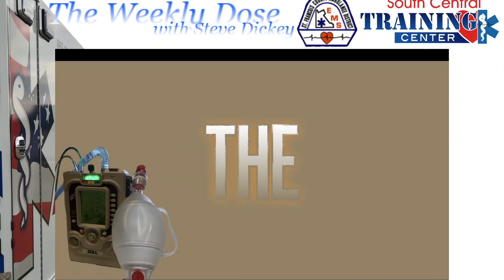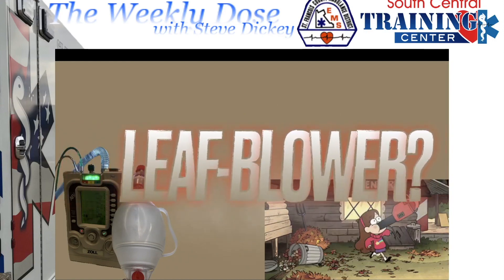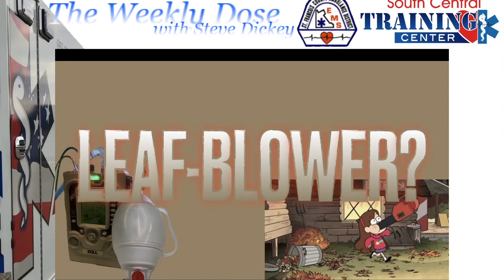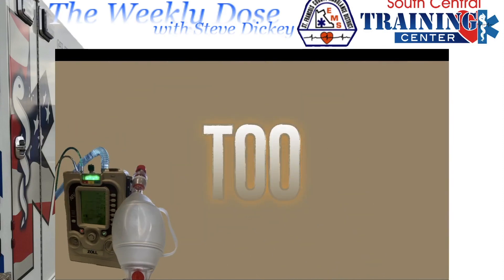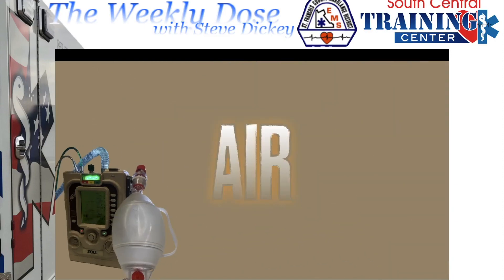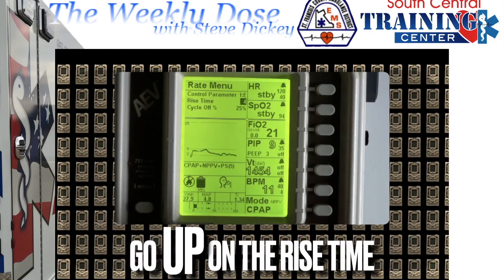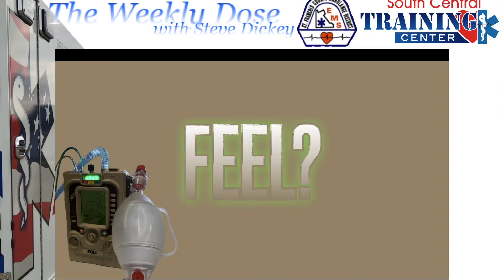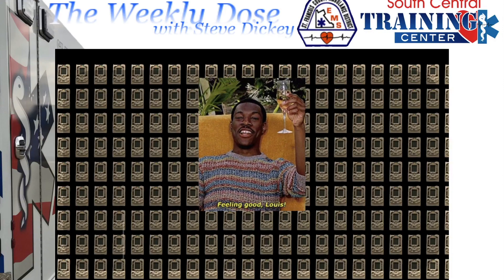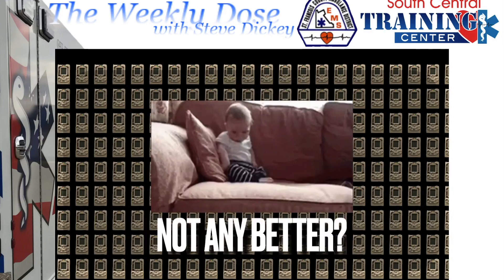Now let's talk about the leaf blower to the face — that's too much air. Remember, start with rise time. In this situation, go up on your rise time, adjusting it up by a single point. How does that feel? Better? Good — let's let it ride. Not any better?